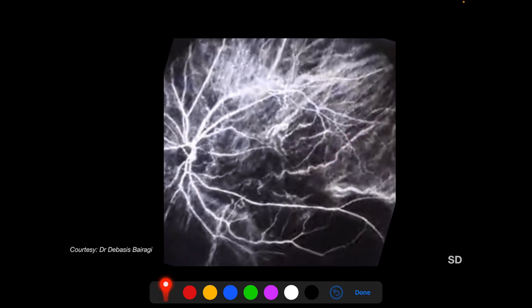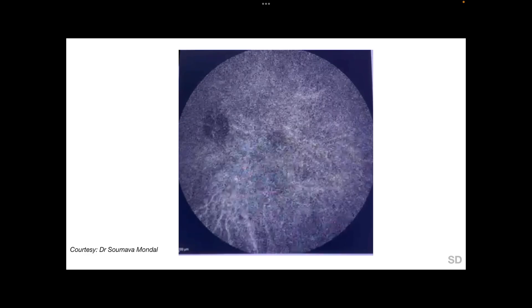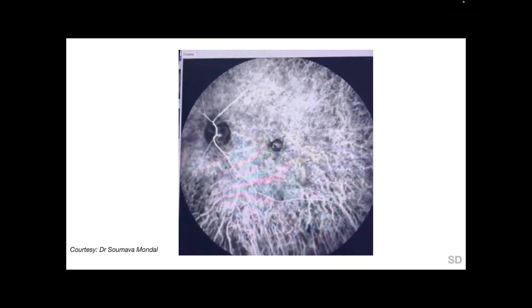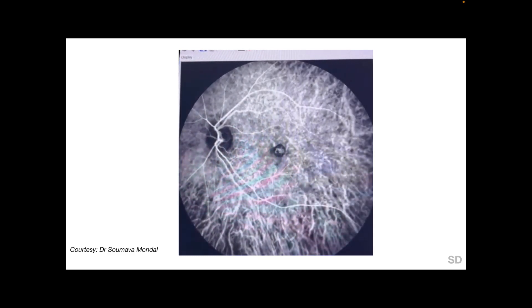We see large choroidal vessels lying in the posterior Haller's layer, medium-sized choroidal vessels in the Sattler's layer, and smaller choroidal vessels or choriocapillaries lying most anteriorly in the choroid. In the video, we see the choroid filling first, following which the retinal circulation fills, and within a few seconds both the choroidal and retinal circulations start to fade.